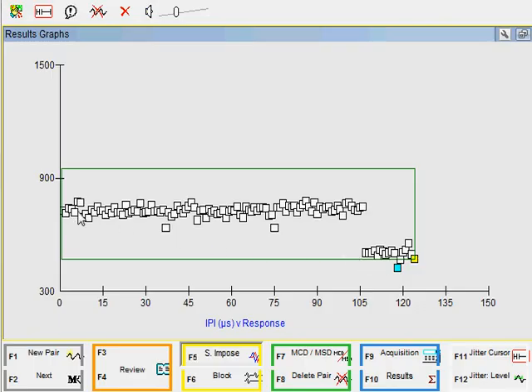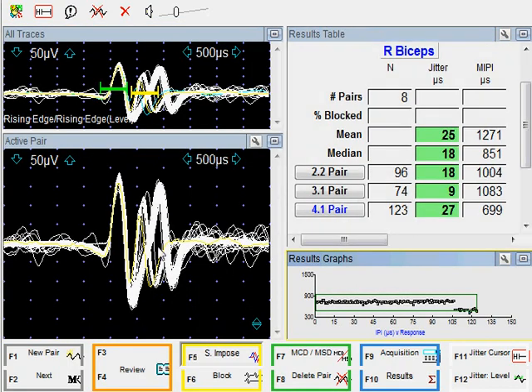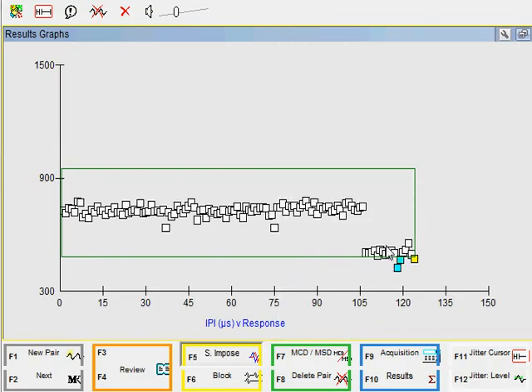In this case, I was recording from this motor unit, and then my needle position slipped, and we started, fortunately, recording from another pair. Again, in past, this used to be tedious to exclude the traces from two different motor units. We had to go trace by trace and get rid of them. Now we have made some improvements in the data editing tool. So here is the way we do it.